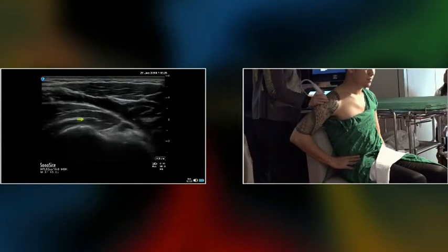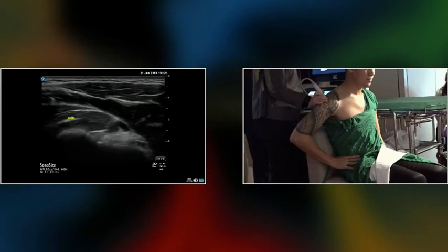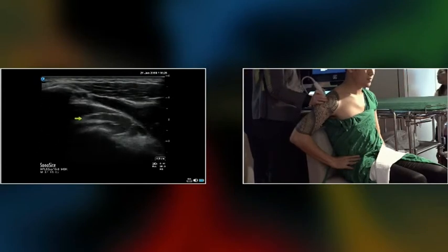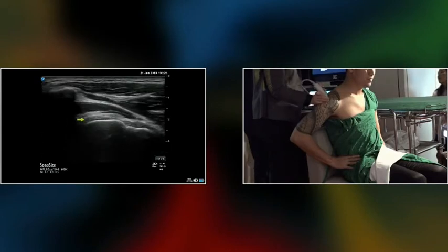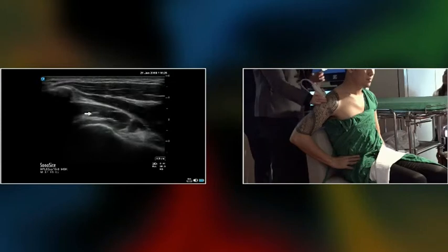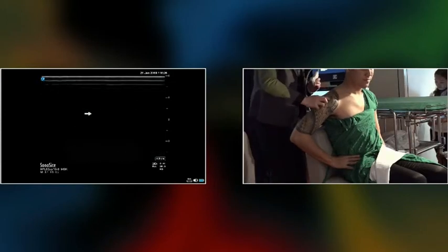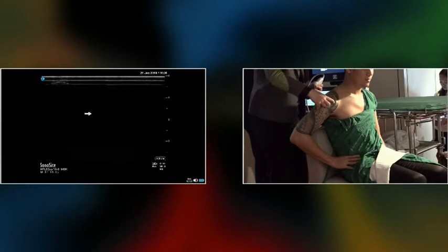A lot of people may have pain at this junction, the myotendinous junction, when they overwork, and with repeated sprain and strain. So actually this is a very big muscle, and also a thick fascia. From here to here, you can scan the whole bulk of the supraspinatus and also the myotendinous junction.